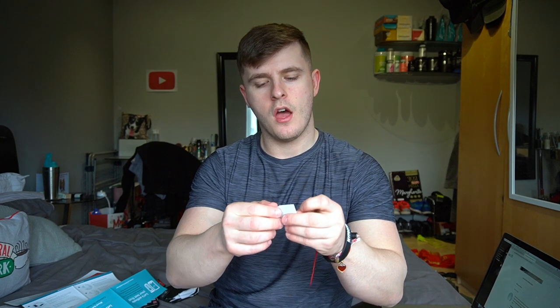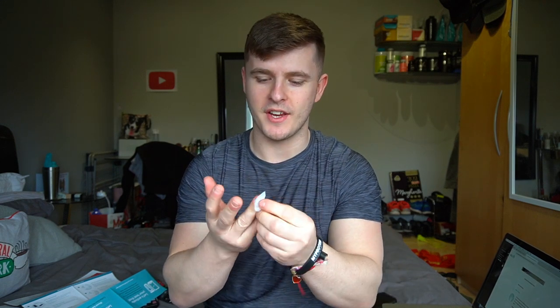Now, this is going to be interesting because I won't lie to you guys — I don't like needles, so if I can kind of get through this, then so can you guys. I'm not a massive fan of needles, I hate having injections, you know, when you go on holiday and you have to have a massive injection, needles stuck in you — nah, it's not for me.